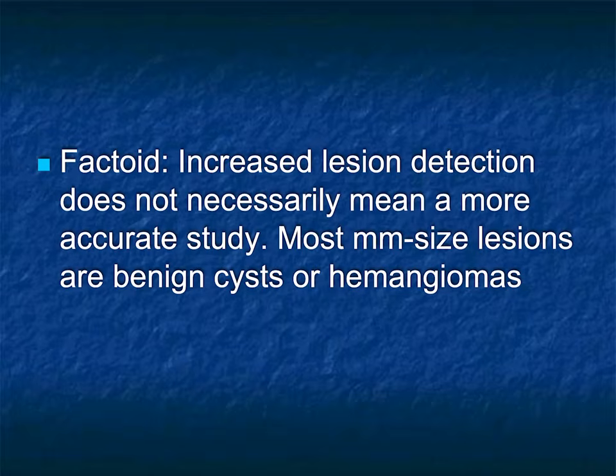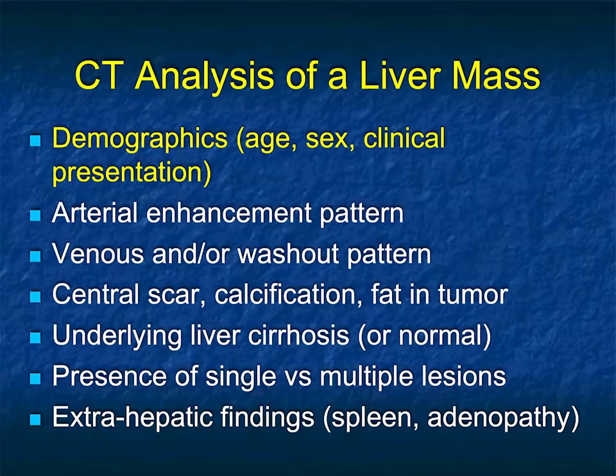And then in a patient with a malignancy, be it a colon cancer or a pancreatic cancer, what do you do? Does the patient have liver mets? Well, you can get another study, but MR or PET scan usually is not going to be helpful on tiny lesions either. Do you do surgery? Do you assume it's benign? Do you assume it's malignant? Perhaps going forward, liquid biopsies will make a difference, but simply detecting the lesion is not enough. So in this talk, what I'm going to focus on a lot is looking at what lesions look like, what they could be, and more, what they actually are.